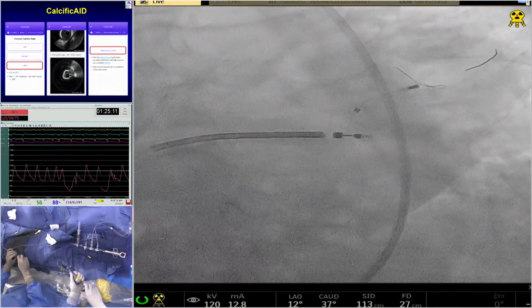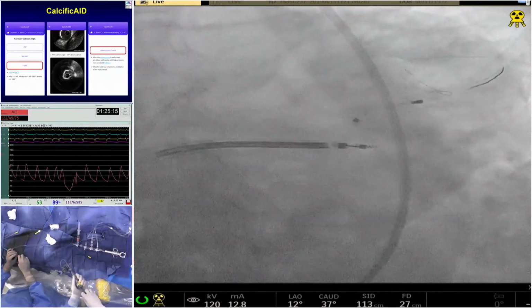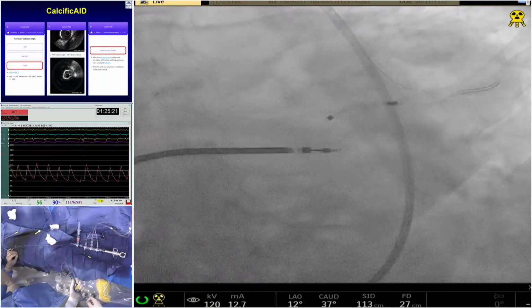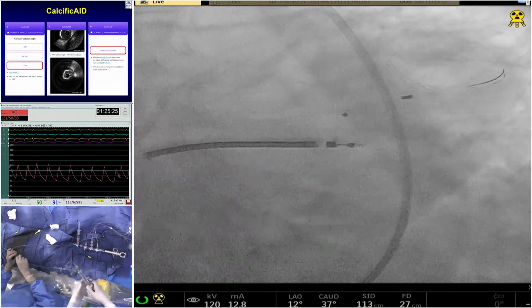Well, we don't have that here, so what would you do if you don't have it? Maybe 12-14. They're taking it away from the legs. I don't know when we're going to get it for the arteries here. It's hard to get it in the heart altogether. Yes, Dr. Matthews.